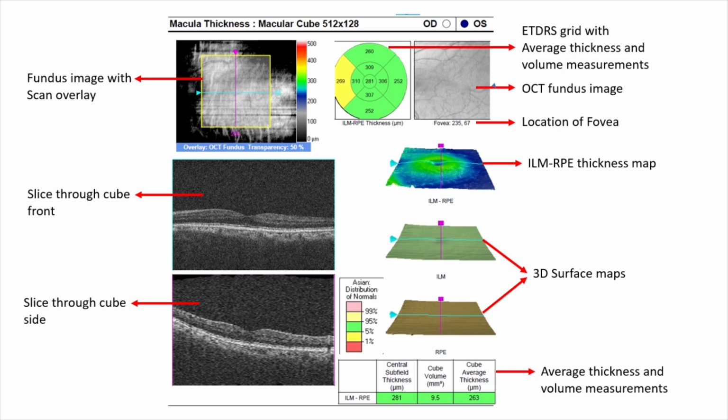Ma'am, age, gender, race, means it is Asian population. Yeah, this is Asian population. You take age, you take gender, anything else? And refraction. Yeah. What refraction normally would you exclude? High myopes? No, there will be a refraction value which says that beyond this, plus or minus.